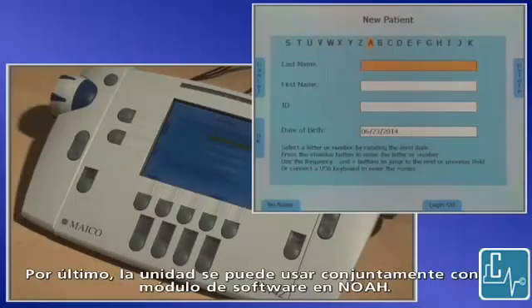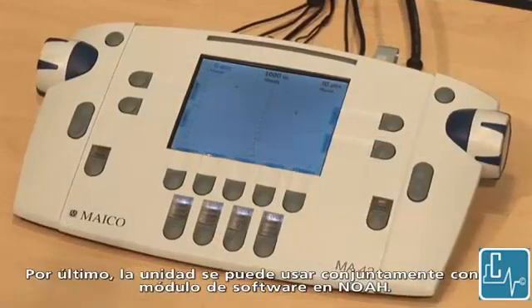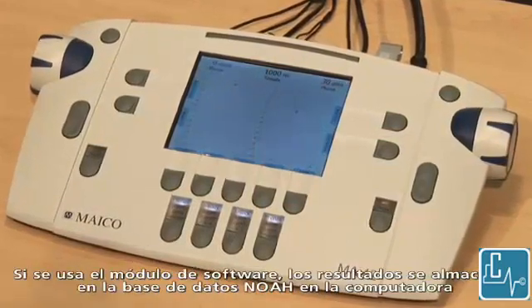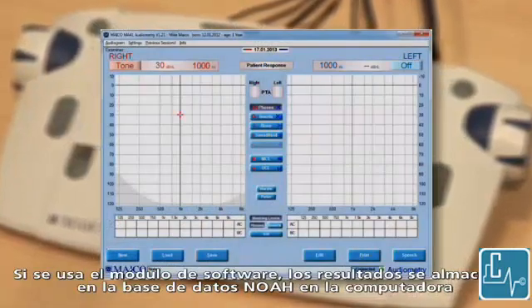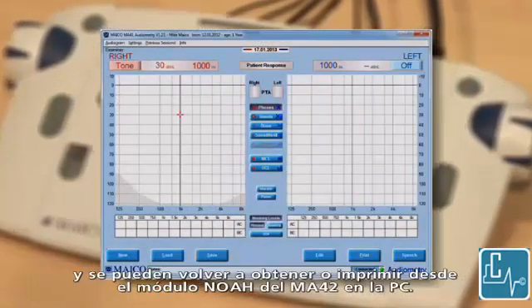The unit can be used in conjunction with the software module within NOAH. If the software module is used, test results are stored within the NOAH database on the computer and can be recalled or printed from the MA42 NOAH module on the PC.